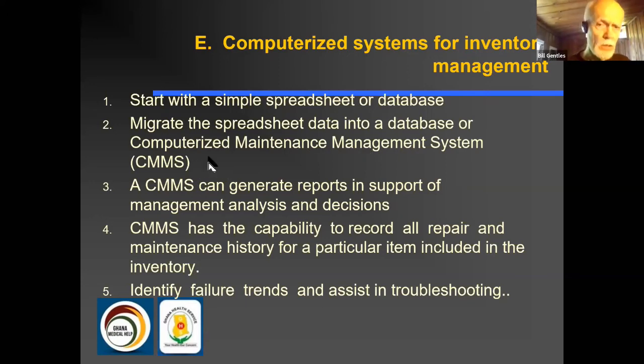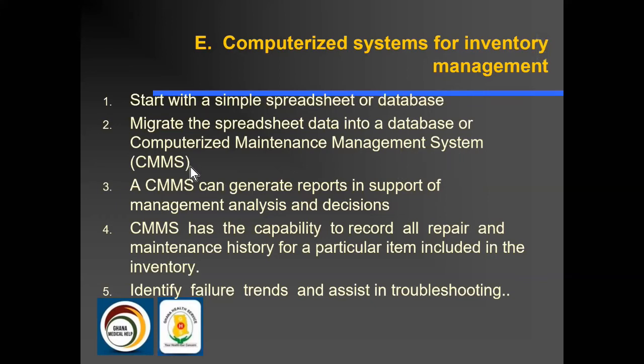But widely used in Canada or the US are commercial systems called Computerized Maintenance Management Systems, or CMMS. They're fairly expensive.